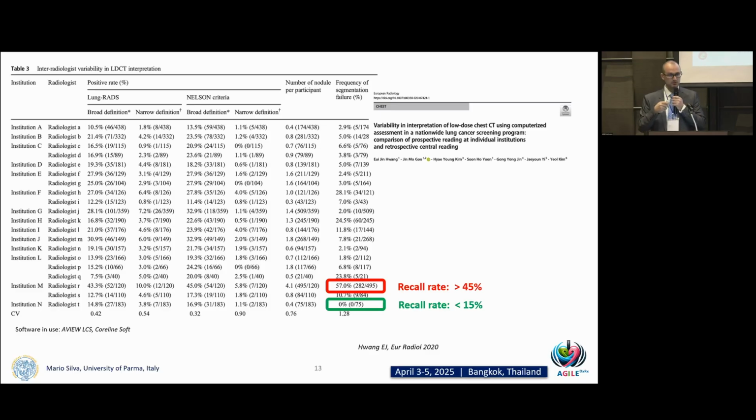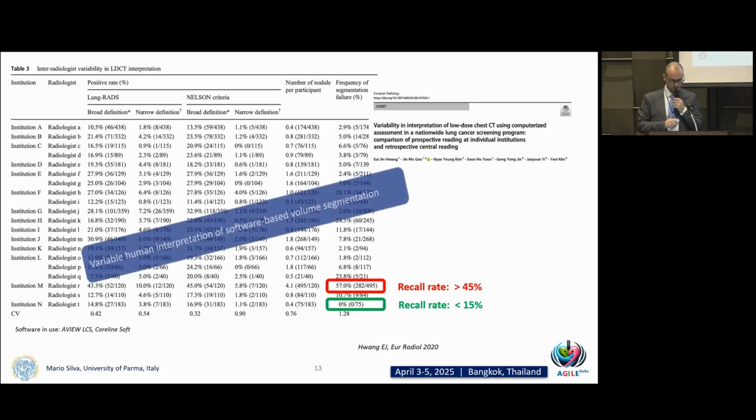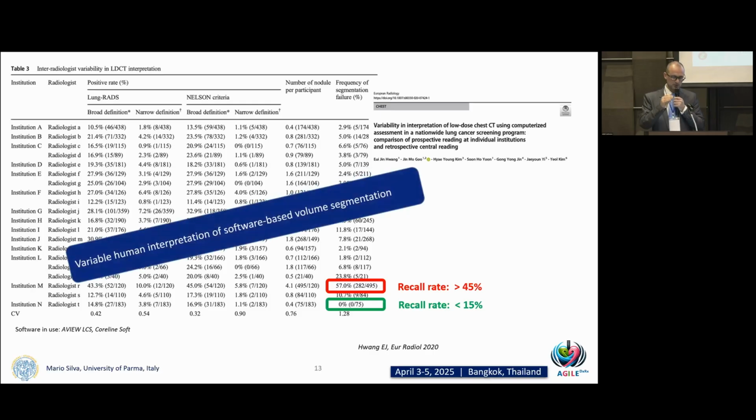Because you reduce the variability based on the manual measurement. You just keep the variability related to the software algorithms that are applied and stretched within these features. So when you use a software, we're on the safe path to be reproducible, but still there is some degree of variability depending on our own use of that software. And as I've said, there are different software approaches that can help reducing the variability.